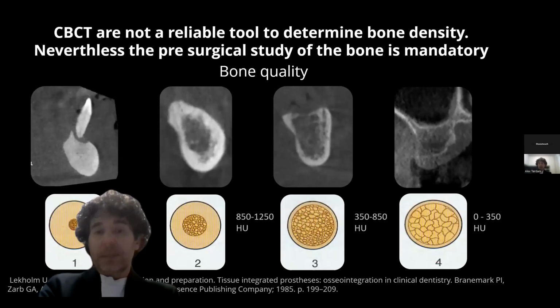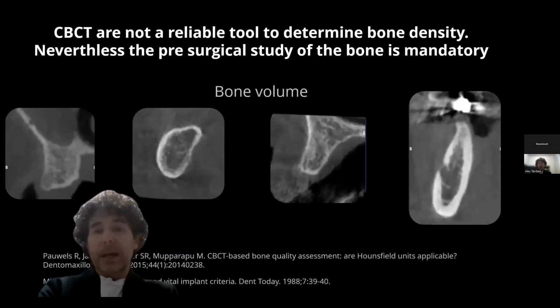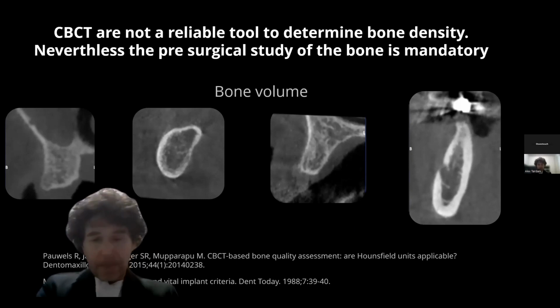So, first, you need to perform the classic bone quality assessments, evaluating the thickness of the cortical and medullary bone, and then also its shape. Because another great advantage of the mallet, especially in guided surgery and in the maxillary premolar and canine areas, is that it can be used not only to improve bone quality, but also for minimal expansion in ridges that might be sufficiently long, but are often slightly narrow from a buccolingual standpoint.